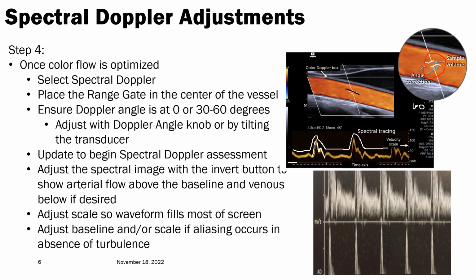And then as the hydrostatic pump, or the potential energy of the artery, kind of kicks in and does another little compression, you see forward motion of that blood throughout diastole again. So this would indicate that you have a very low resistance spectral tracing of an artery.